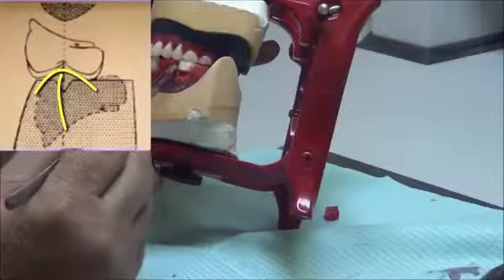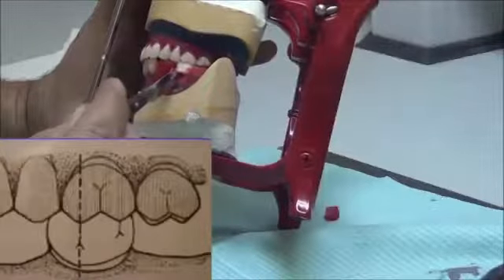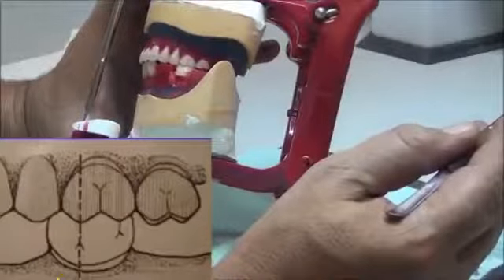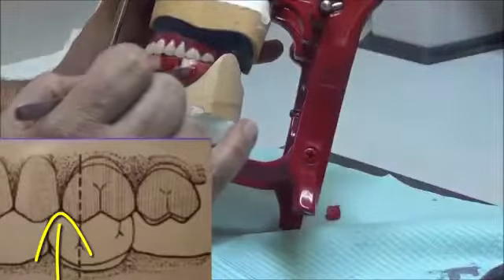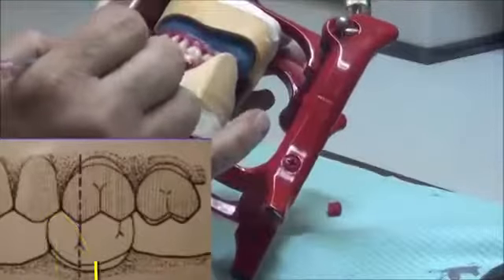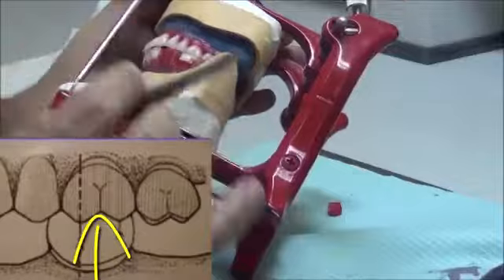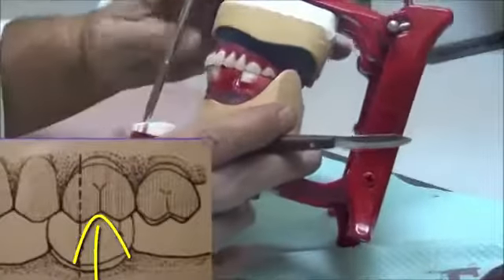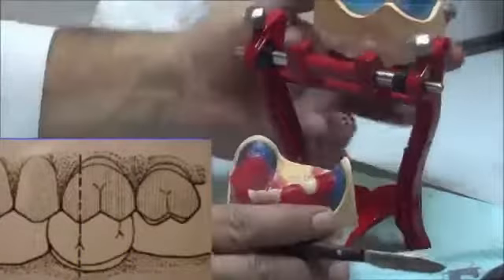After we put it into place, we put the cusps in location buccally, and we make sure it's in location. The mesial cusp of the lower is in between tooth number 6 and tooth number 5. The distal cusp is a bit less than the distal cusp of the upper molar. So it's larger mesiodistally than the upper molar, so it extends for a longer period.